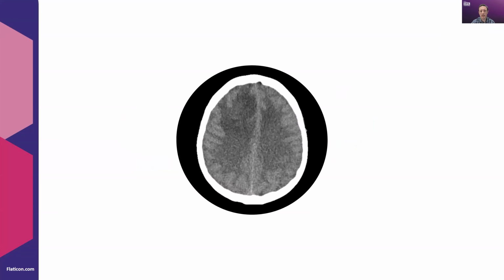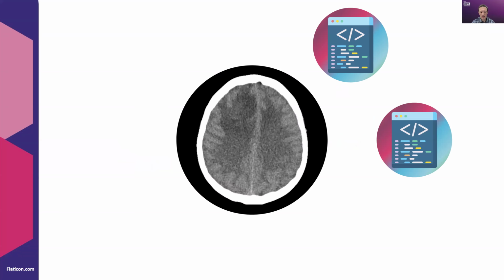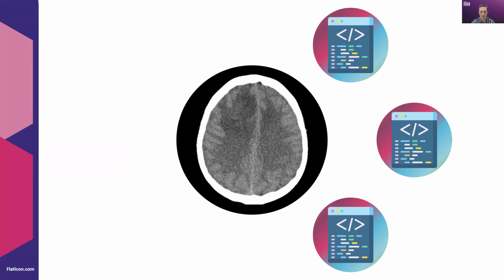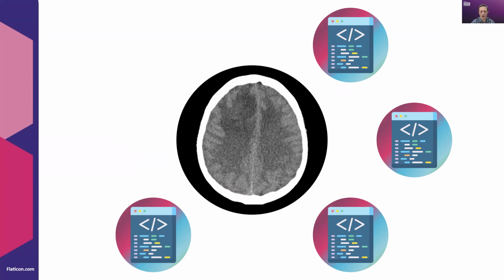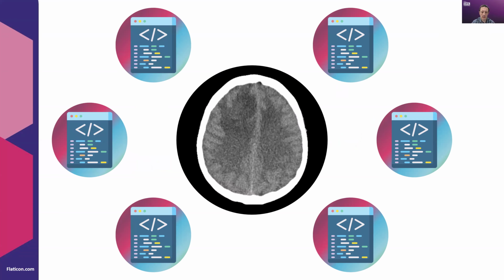And so those same CT scanners that were putting out images all started to have that same file format, that same type of information. It was a way to have those machines work across an enterprise and in a distributed fashion so that radiologists could work and see images no matter where they were and no matter what system they were using.